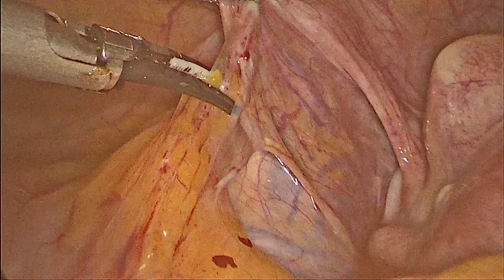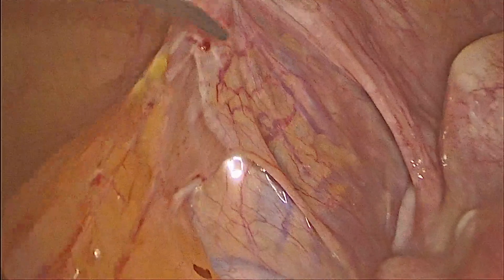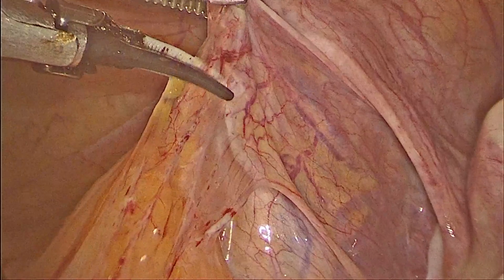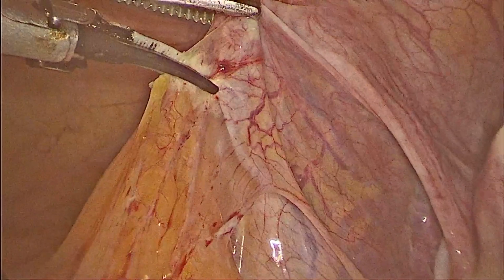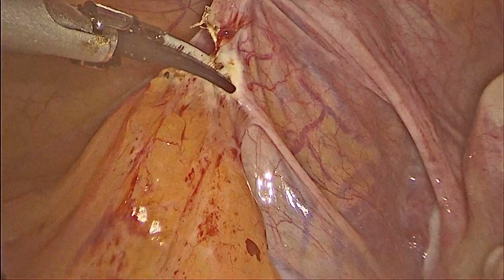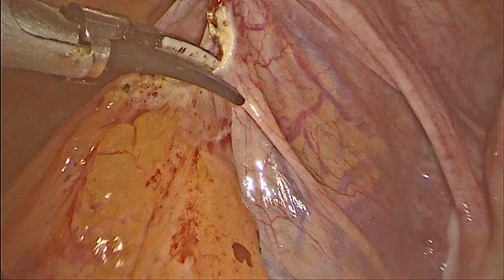Few sigmoid colon adhesions, which may be normally seen, are released to get proper access so that the sigmoid colon can be moved away from our surgical area.